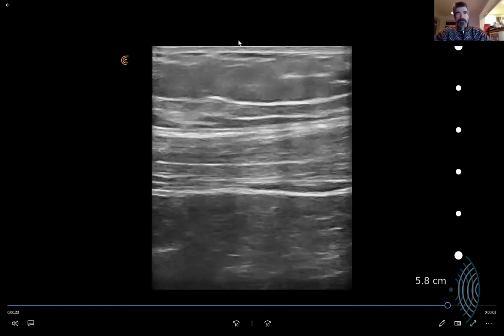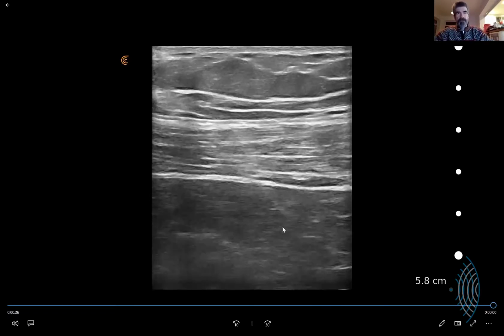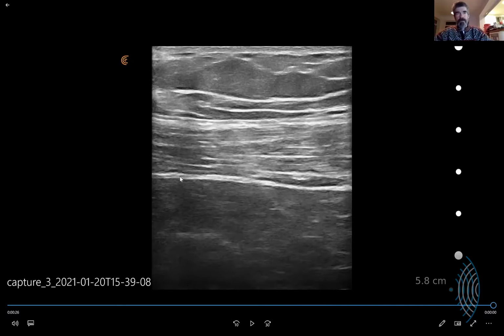Would my eyes be? I guess that's what I don't know. I know this stuff to be kind of a poopy, fluidy junk. But is this line relevant to your eyes as I'm scanning that? So let me pull up another one, because I know I found something underneath this. But what I was saying to myself was, this line needs to somehow be compromised, and there should be some fluid or something up in here if there's something. And if he bears down or blows on the back of his hand or whatever, it would be good to see that fluid or that junk go up and down.